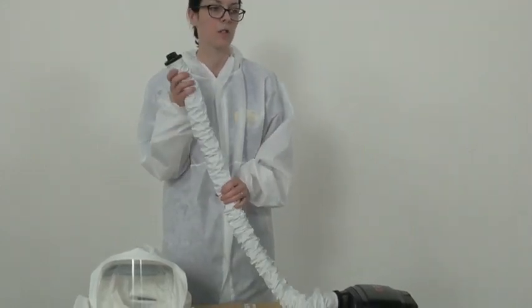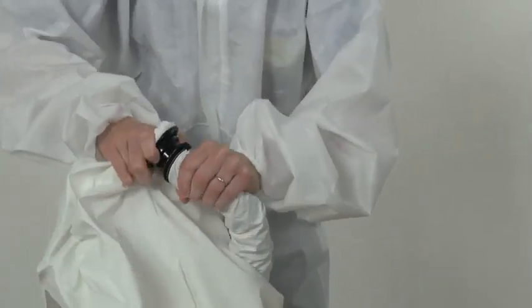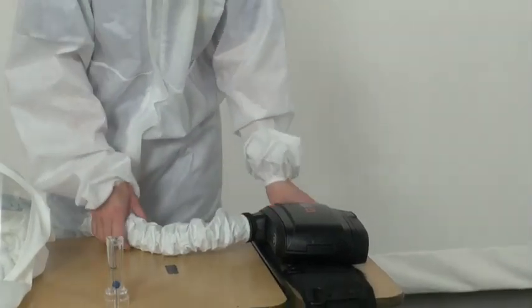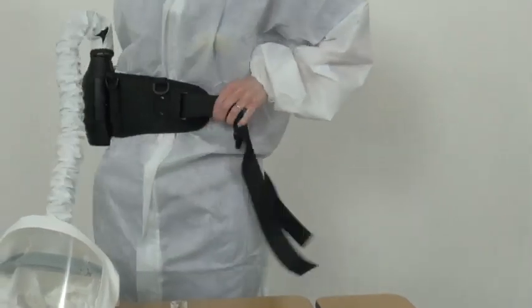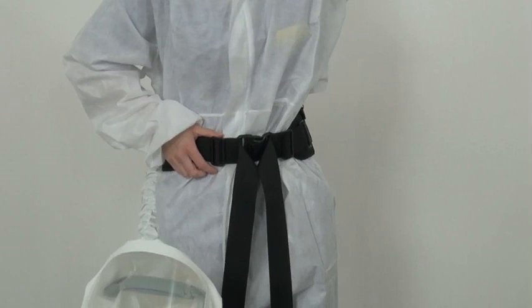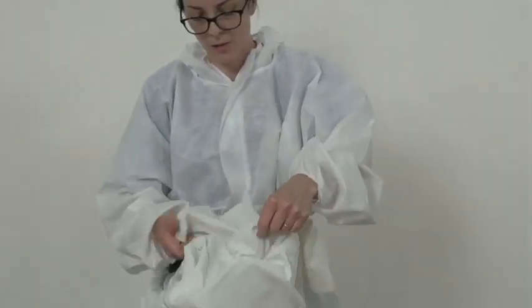Connect the air purifying respirator to the hood. Attach waist belt over PPE to avoid obstructing air flow. Turn power on and place completed hood overhead.